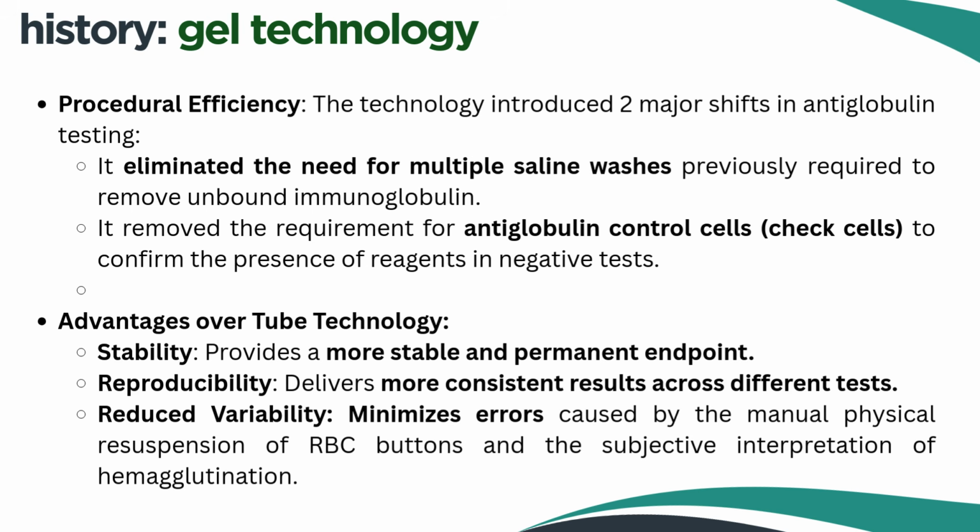And secondly, the technology removed the need for antiglobulin control cells, commonly known as check cells, to verify the presence of reagents in negative tests. And this was a significant advancement in simplifying the workflow and improving overall efficiency.